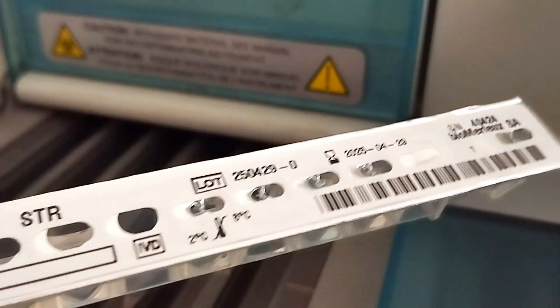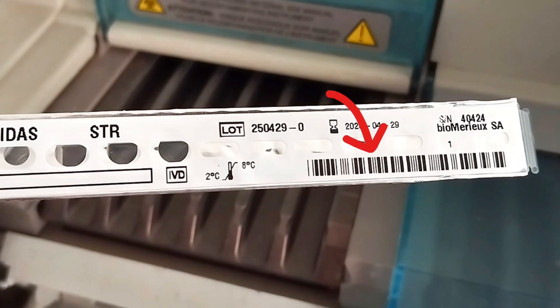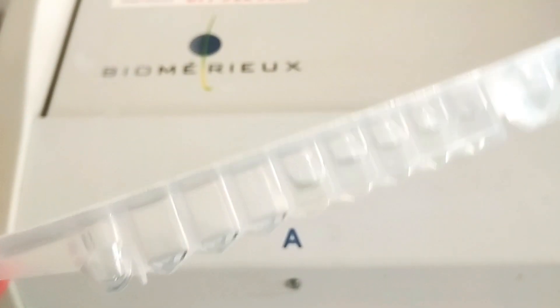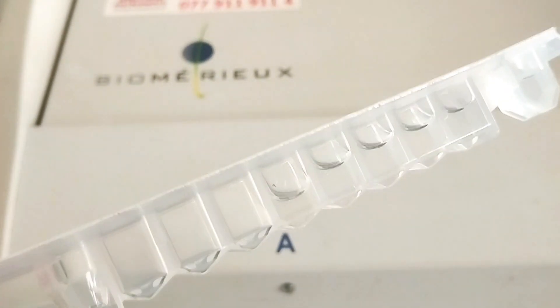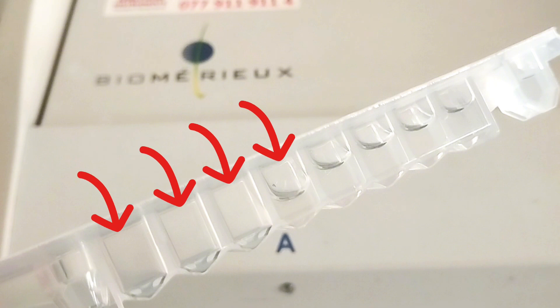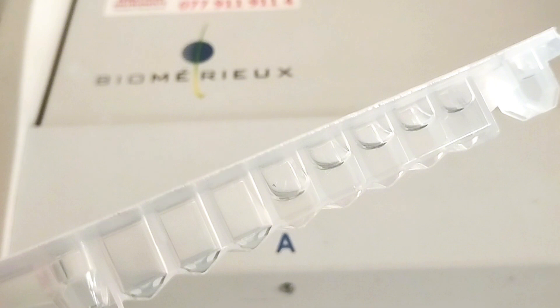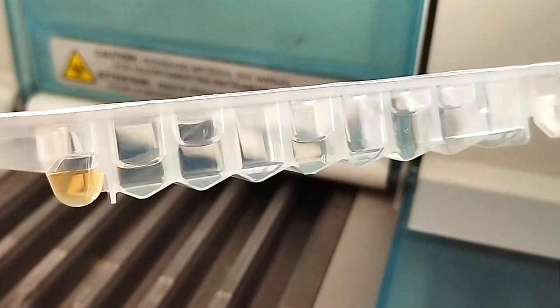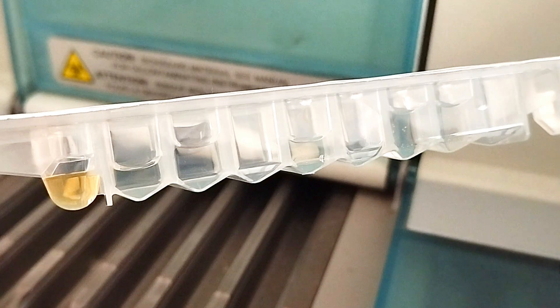Each strip also has a barcode to ensure the right test is performed on the system. The strip has several compartments which are used for sample and reagent interactions, typically including wash, substrate, and sample zones. After the test is completed, the strip contains residual sample and reagents.